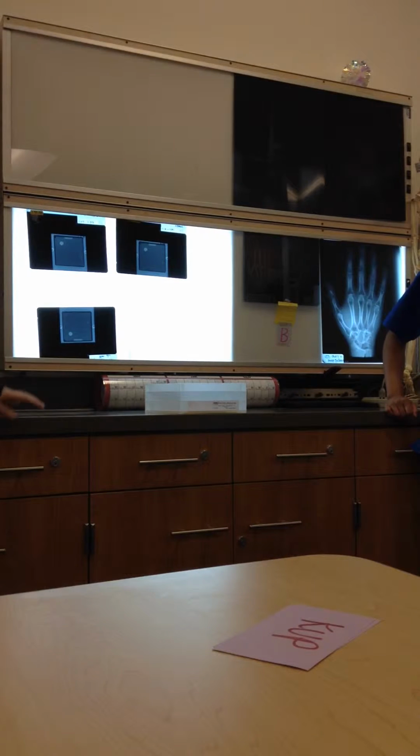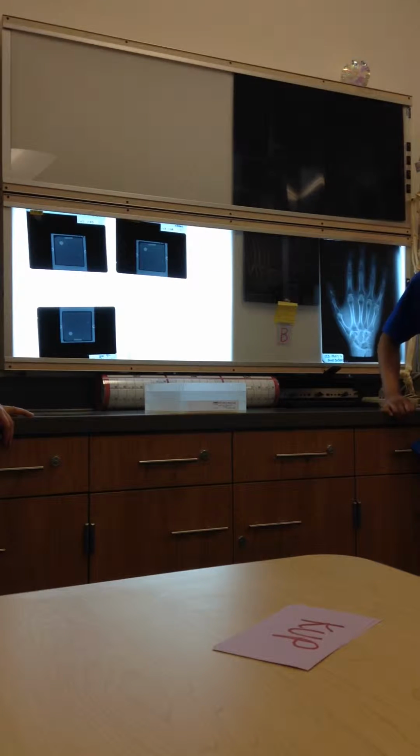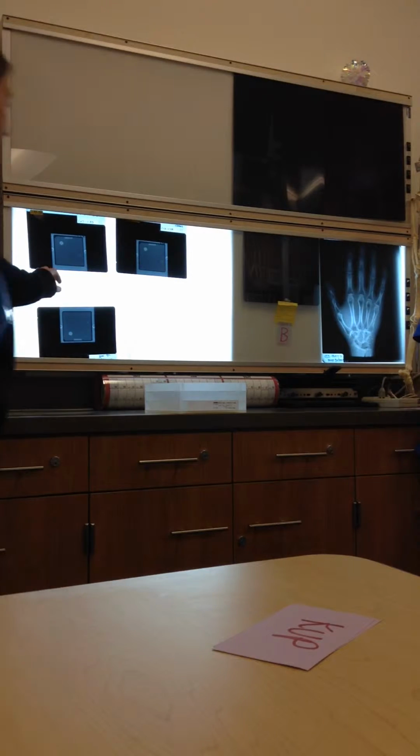That dot there is only to get your base density. That circular dot that's on there, that's not part of the masses. We just put that in there so you can see the base fog. All right, and how often is this done? Weekly. Yeah, and what does it test? To check the quality of the imaging. Good. Alright.